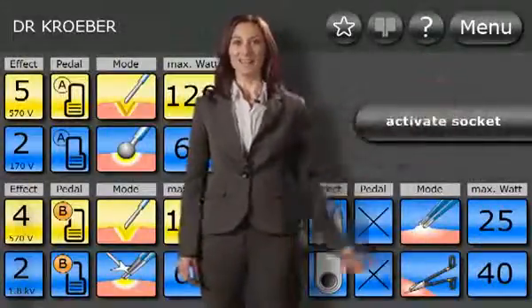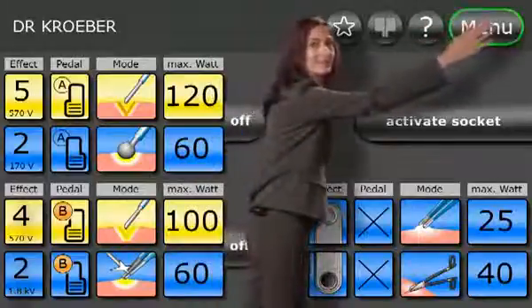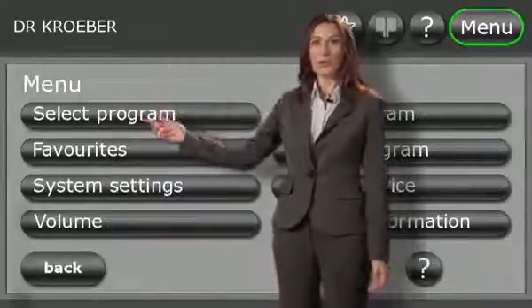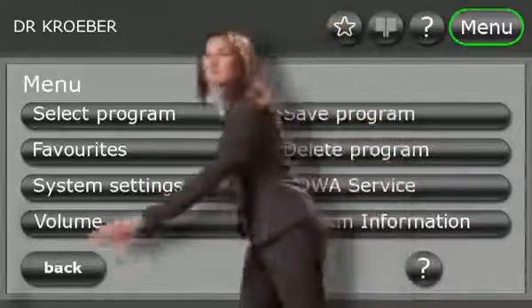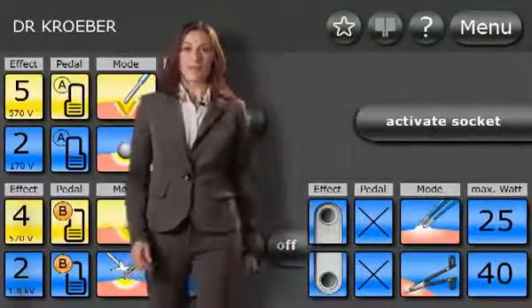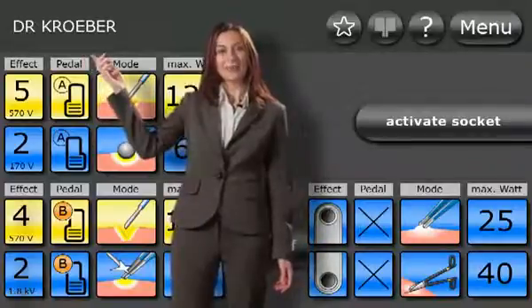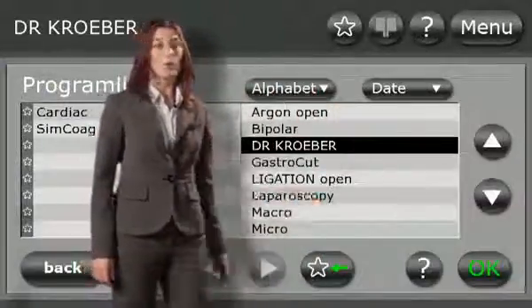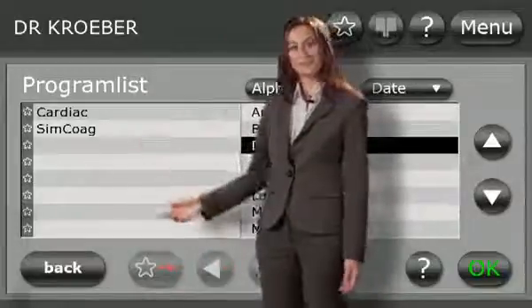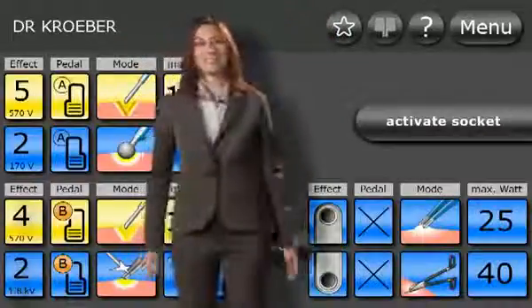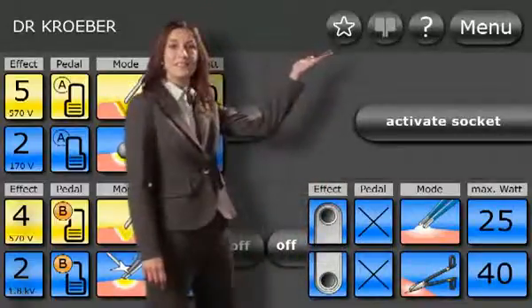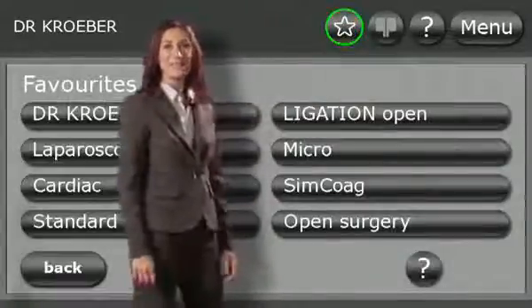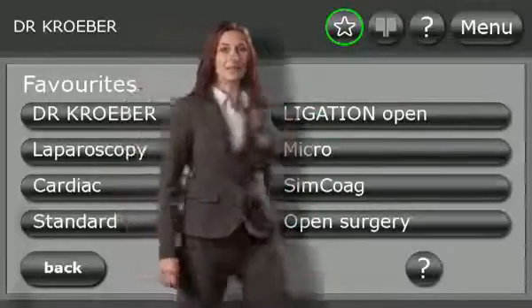Switch over to the main menu by touching the menu button. Here you can manage your programs, adjust your general system settings and set the volume. To access the program list, simply touch the current program name. Here you can select programs and assign these to your favorites. You can access your favorites anytime using the star button, and select your favorite settings by touching the appropriate button with your fingertip.